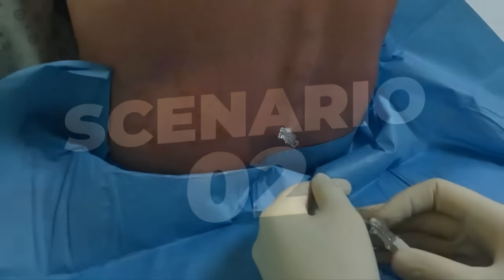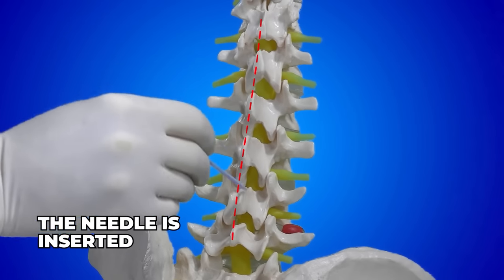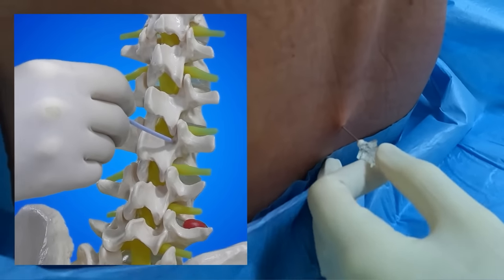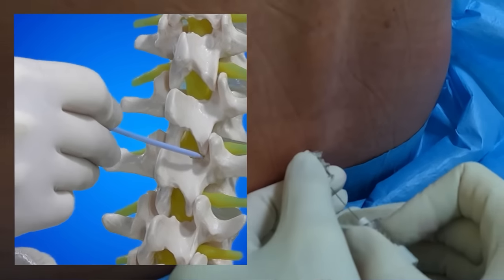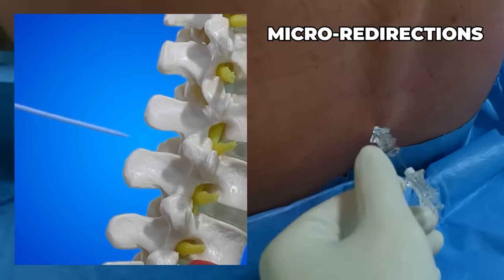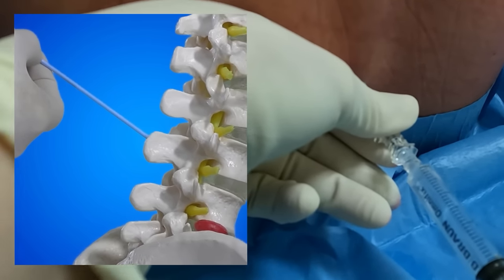Scenario number two: the needle enters and touches the bone deeper, at about two to four centimeters. This means we are not in the midline — we are paramedian on one side or the other, and the needle is now touching the lamina. In this case, withdraw the needle to the skin and perform micro-redirections laterally to one side, then the other, or slightly cranially. The key word is micro-redirections. Never redirect caudally, because the needle can never enter the intrathecal space if reoriented caudally.